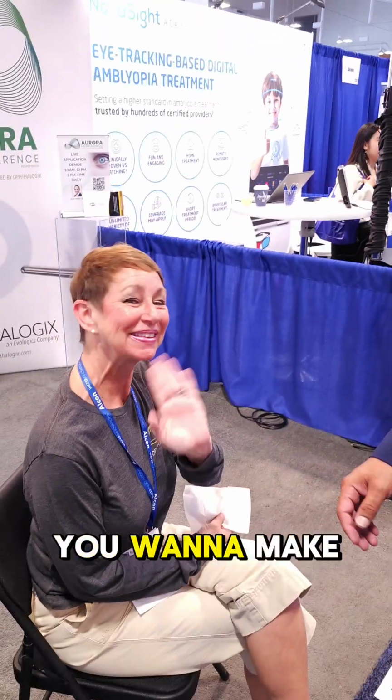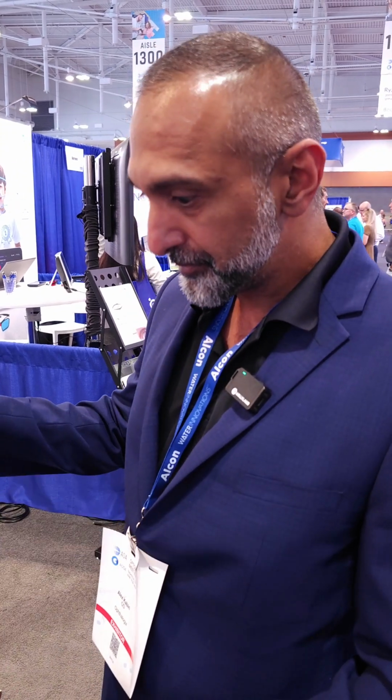We're going to show you how to apply amniotic membrane to the front of the eye. One of the key things you want to have is, of course, the patient, right? No patient, no procedure. You want to have a patient. You want to make sure that you understand what you're treating and why. Usually we're treating some form of keratitis in the office.